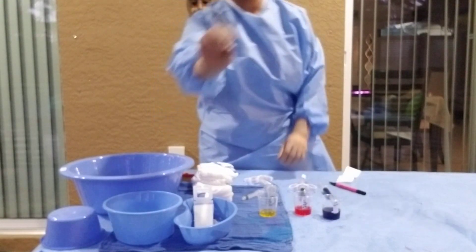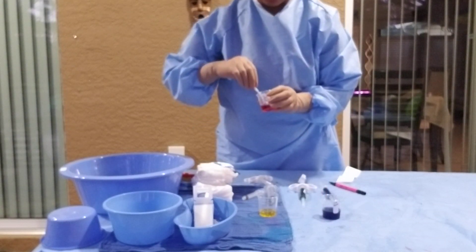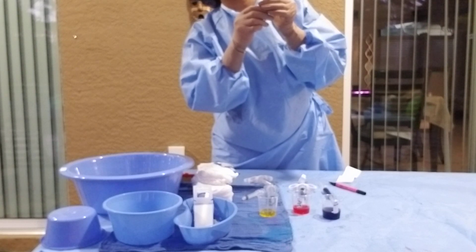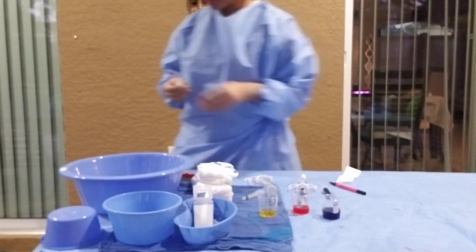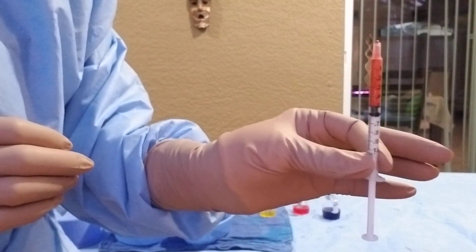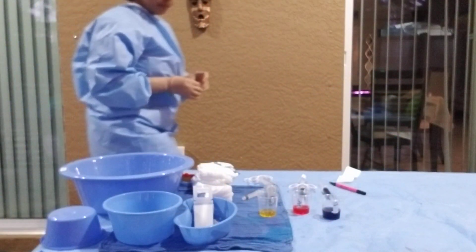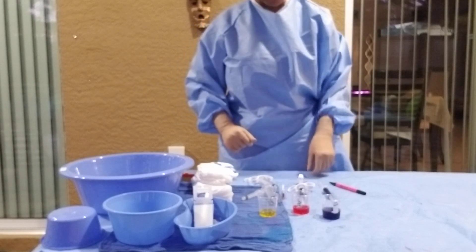Last, we have our 1 mL TB syringe — a tiny little syringe. The surgeon wants 0.5 mL of 2% lidocaine, so I fill it to 0.5 cc. On a 1 mL syringe, half a milliliter is 0.5. Labels are very important — you should always label everything prior to it being administered to your table.